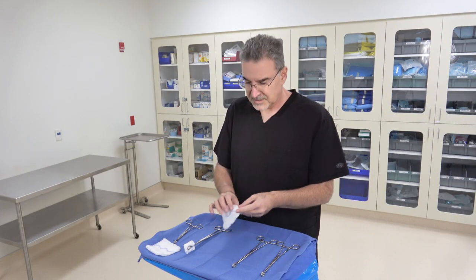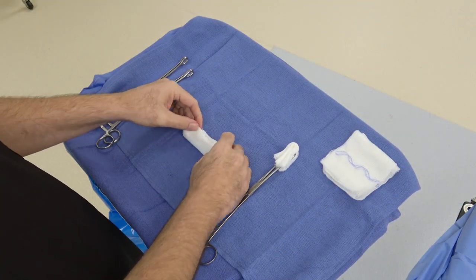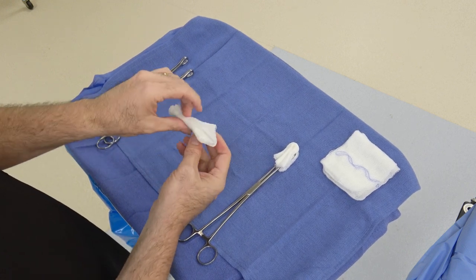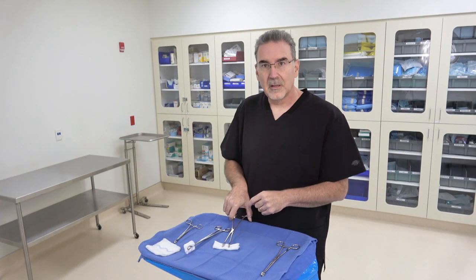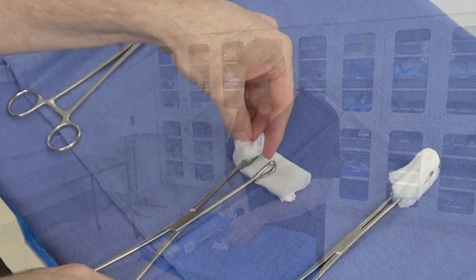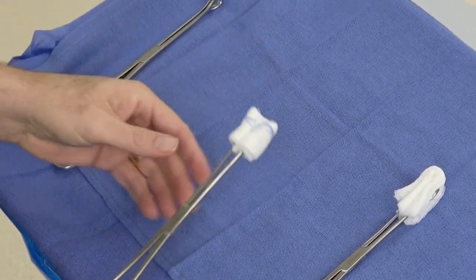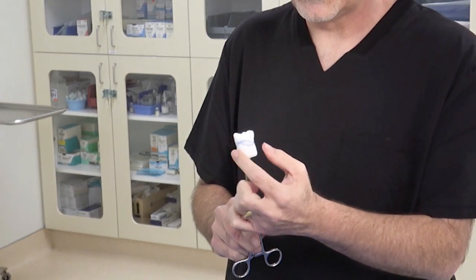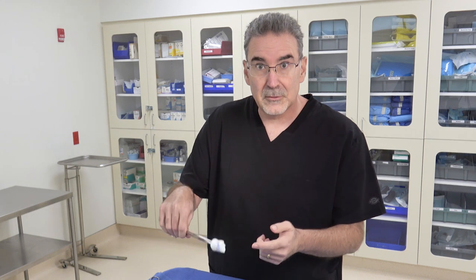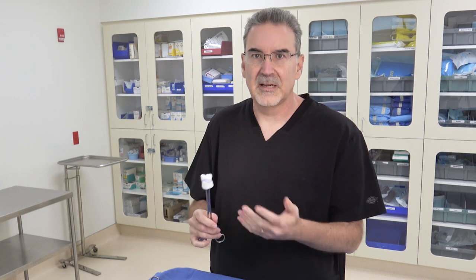The second way of creating a sponge stick starts out similarly. Fold the RayTac into thirds again, then turn it over making sure the blue stripe is on the outside. Lay it down, place the sponge stick across the middle of the folded RayTac, then take the edges and fold them up, squeezing them in tightly. Pack it down and hold it with your fingers while you clamp down, wrapping the tips of the RayTac all the way around. The blue stripe should be visible — this makes it clear to everyone in the room that it's a RayTac, which is allowed inside the body, not a standard four-by-four.